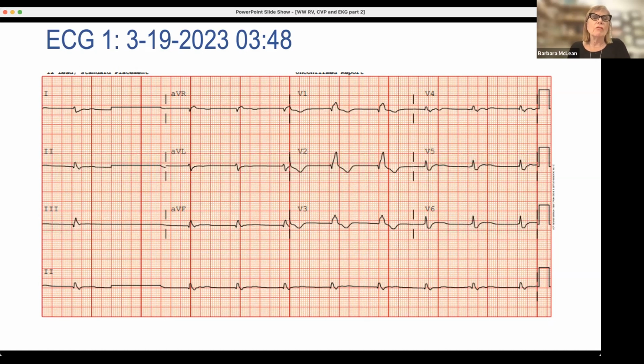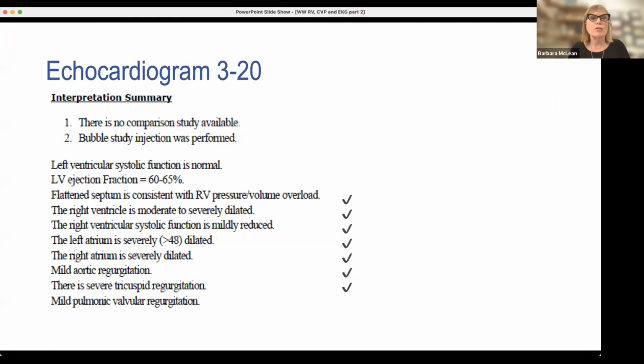So a couple of things you can think about in this patient is that, first of all, she has a right bundle branch block configuration. She looks like she's in an idioventricular rhythm. I would like her heart to beat a little faster, but I don't want to stress her with epinephrine. Don't really want to stress her with anything that's going to increase myocardial oxygen consumption. I would probably do transcutaneous pacing here. And I would do that for the next hour or two until I kind of got everything stabilized and considered what was going to happen next.